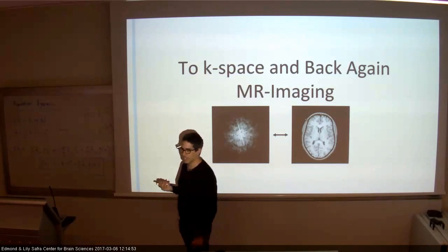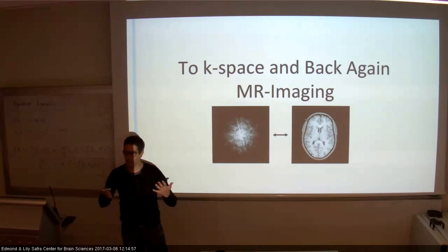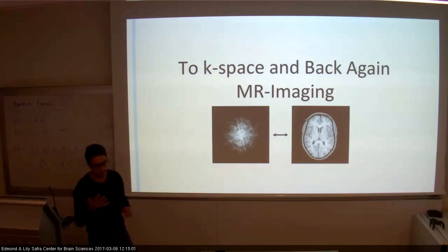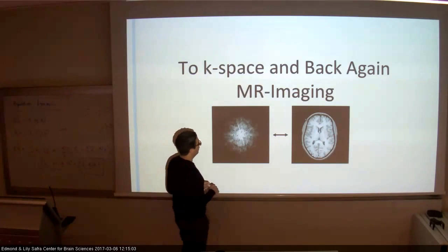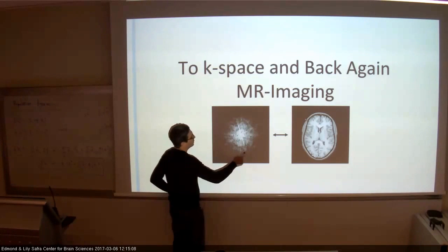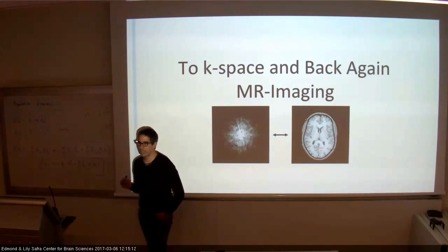That's the strength of MRI. That's why we want MRI, right? It's so nice in humans. We can measure them without opening their skull and so on. So that's the idea. And when we do the measurement, and that's the painful part, we typically measure in Fourier space.